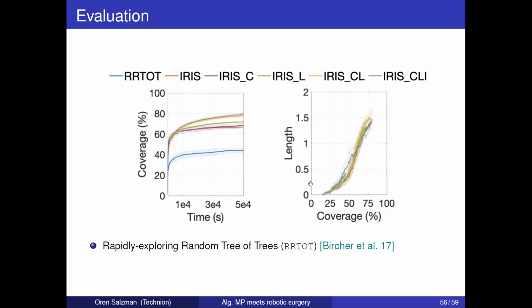We also need to look at the length as a function of coverage, and we can see that there's no degradation in length when compared to the state of the art before us. That's the blue part here.